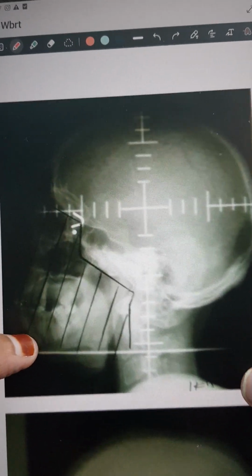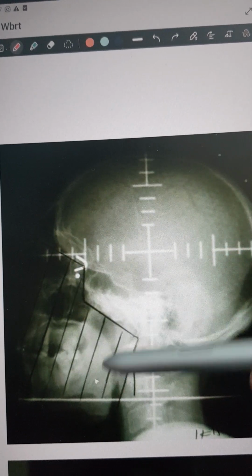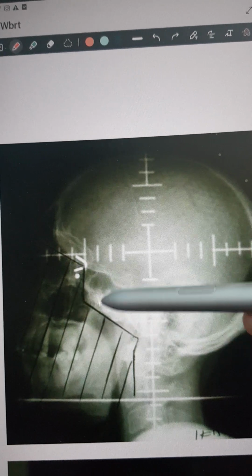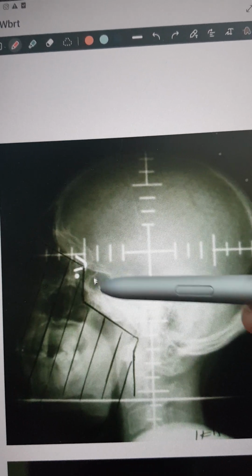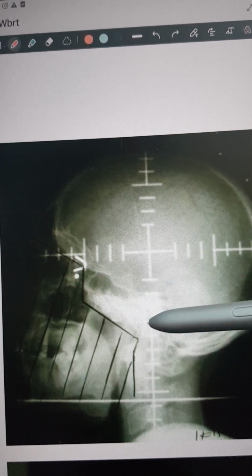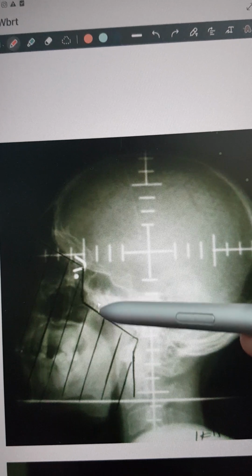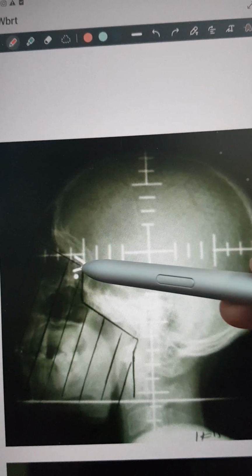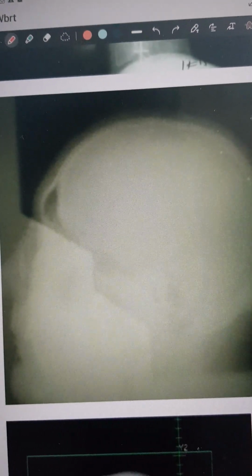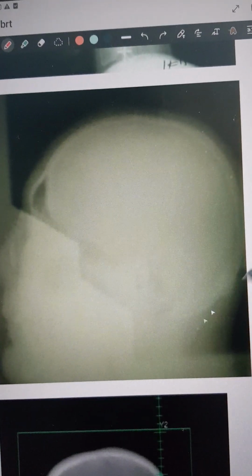So this is our conventional 2D field, with in German helmet you will block this area where there is eye, and so here cribriform plate you will include, and you have to include the hypophysis here, and you have to also include the temporal lobe, and the inferior border will be C2 vertebrae, and it's 0.5 centimeters from the cribriform plate, 0.5 centimeters from whatever you can see the base, anteriorly to 2 centimeters posterior to the lens. Now again the same, this is the exposure, this is the block that has been used, this will be the German helmet technique.